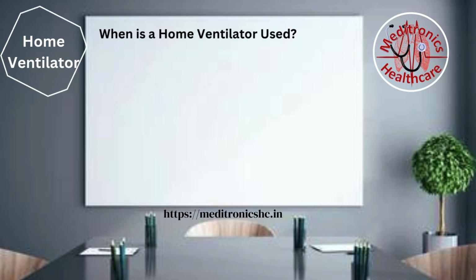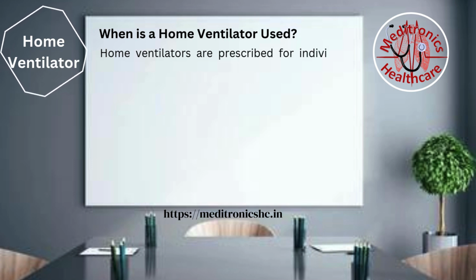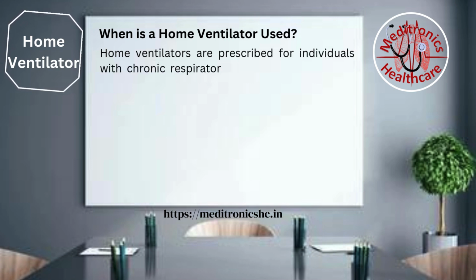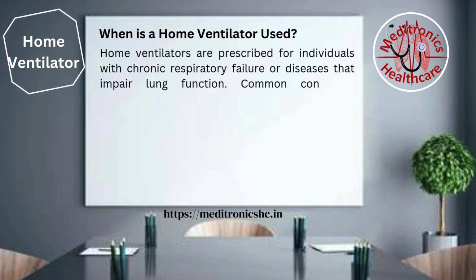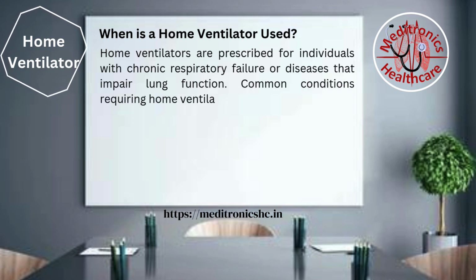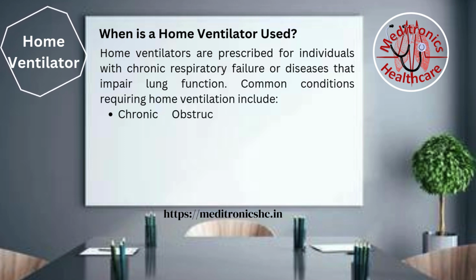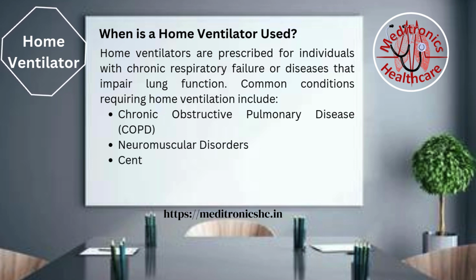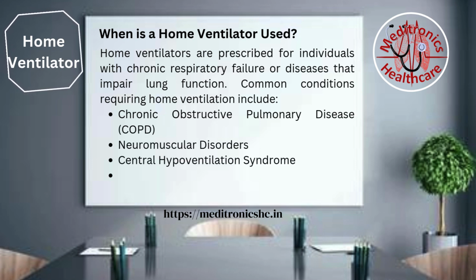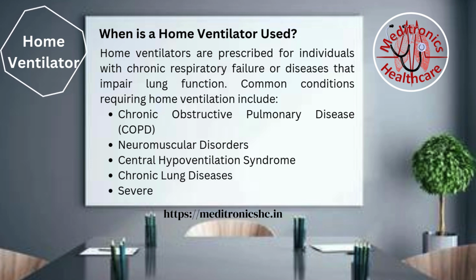When is a home ventilator used? Home ventilators are prescribed for individuals with chronic respiratory failure or diseases that impair lung function. Common conditions requiring home ventilation include chronic obstructive pulmonary disease (COPD), neuromuscular disorders, central hypoventilation syndrome, chronic lung diseases, severe sleep apnea.